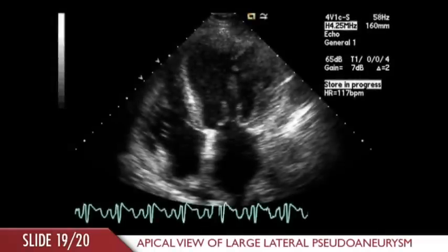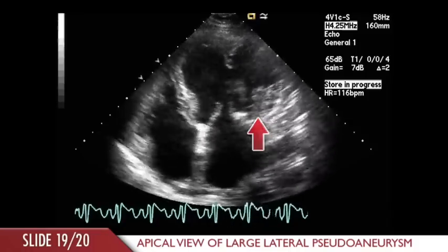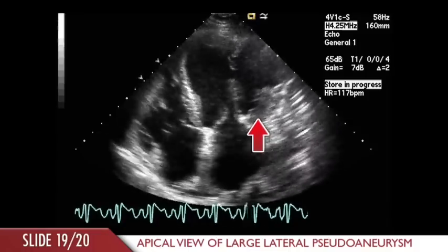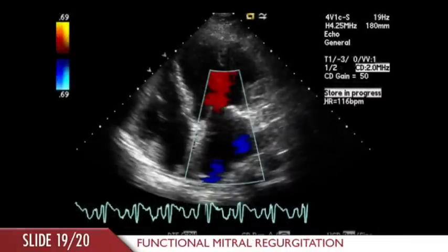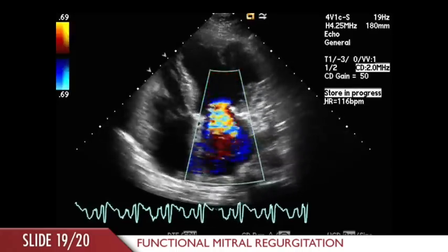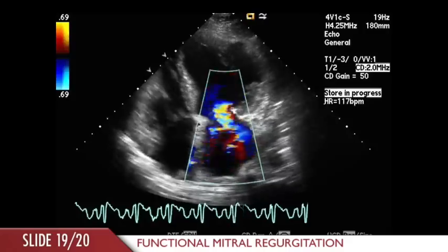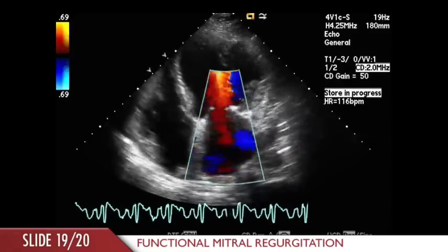This apical four-chamber view was recorded in an elderly patient 7 days following acute lateral wall myocardial infarction. She subsequently developed hemodynamic compromise. Note the large space adjacent to the lateral wall filled with complex echoes representing thrombus and some free-flowing blood. Because of the apical and lateral displacement of the papillary muscles, moderate to severe secondary mitral regurgitation has also occurred. A pseudoaneurysm such as this represents an emergent situation as the risk of further rupture and cardiac tamponade is exceptionally high.